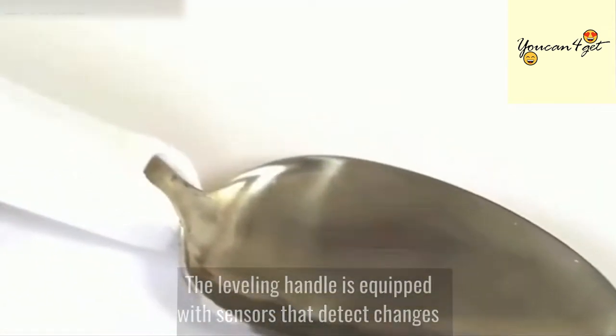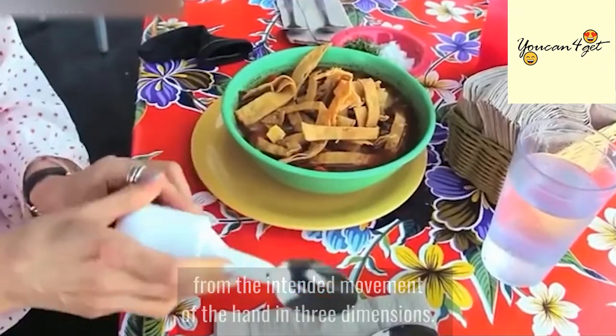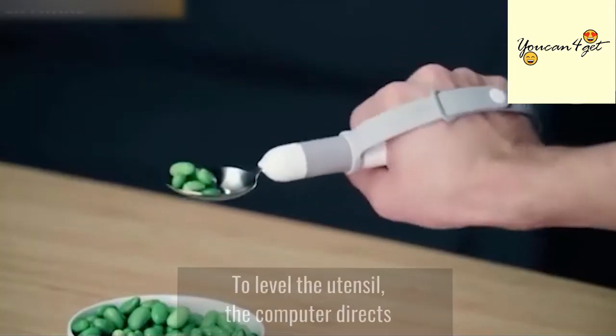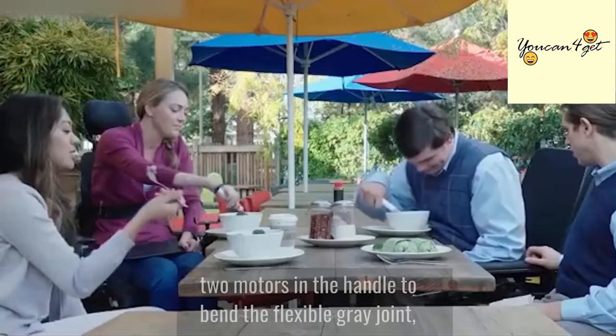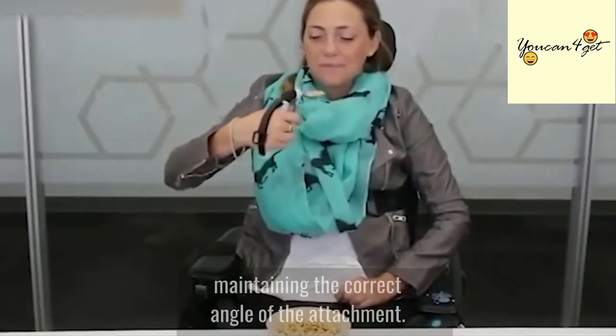The leveling handle is equipped with sensors that detect changes from the intended movement of the hand in three dimensions. To level the utensil, the computer directs two motors in the handle to bend the flexible gray joint, maintaining the correct angle of the attachment.